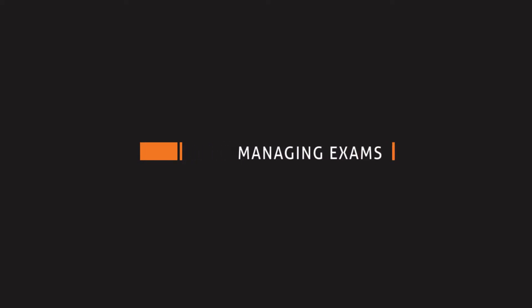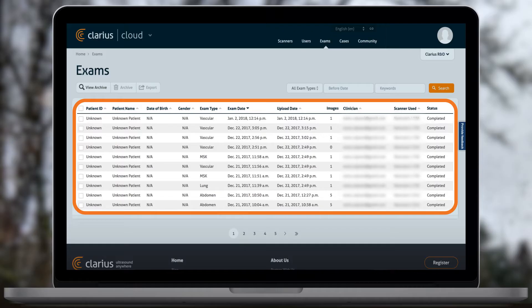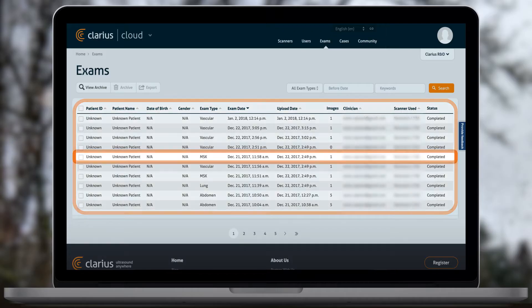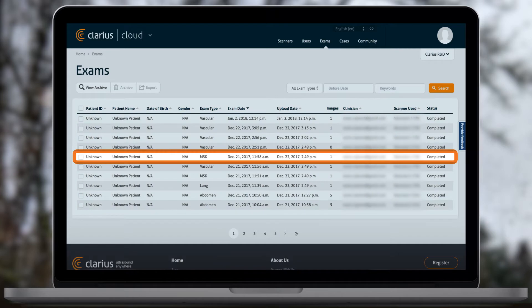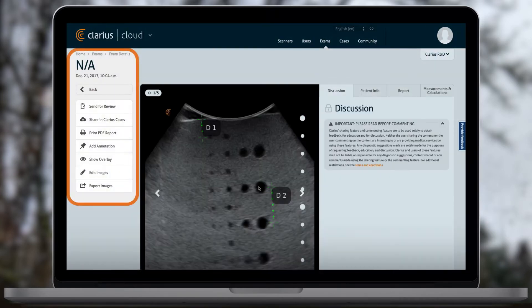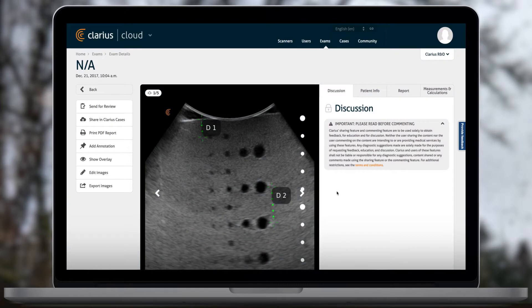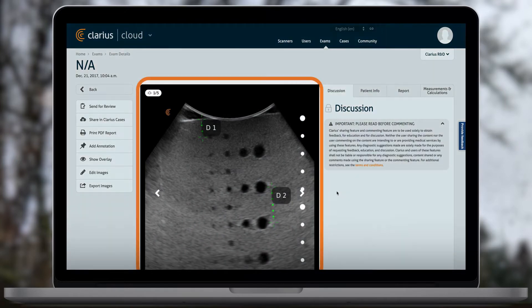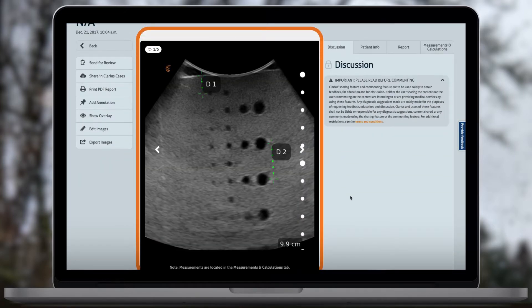Managing exams. When opening the exams page, you will see all of your exams. On the left, you can see a menu with tools and features for this exam. In the center panel, you can browse through all of the images in your exam.